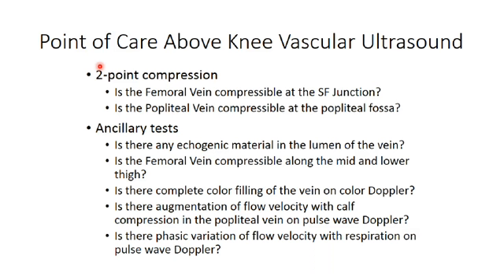Remember, these ancillary tests are not essential for the diagnosis of DVT, nor do they rule it out, but they can be helpful when it's a little bit difficult, when the 2-point compression is not completely certain.